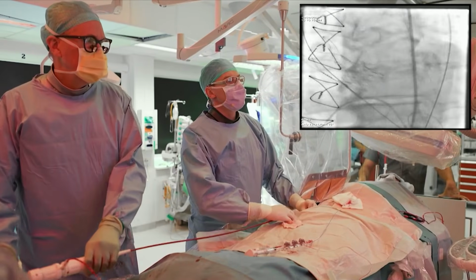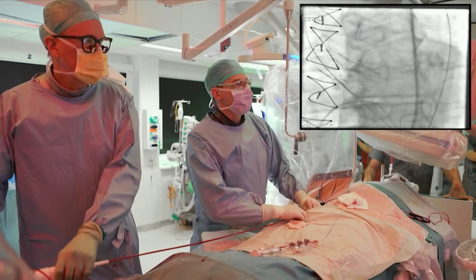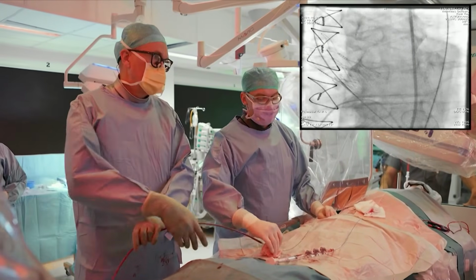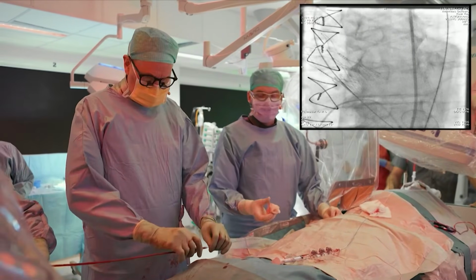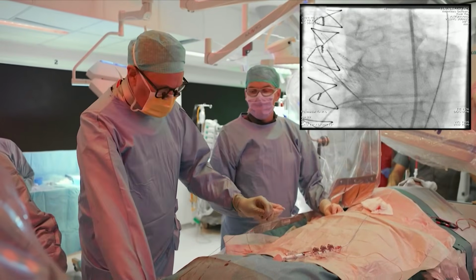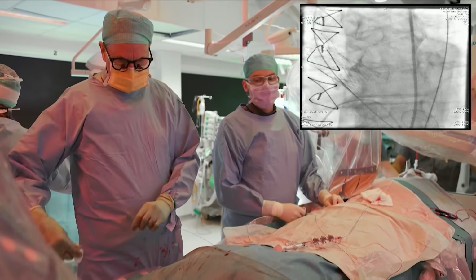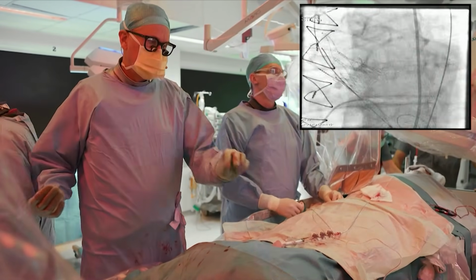So here we can see that the system has been retrieved and we have the wire in place. We typically exchange it for a pigtail just to make sure that we don't have any leak. If you have the wire in place, typically you get a little bit more central leak. So what's your practice on this?